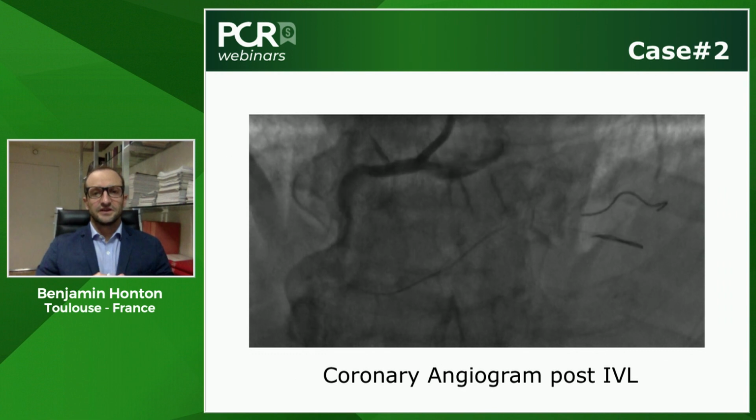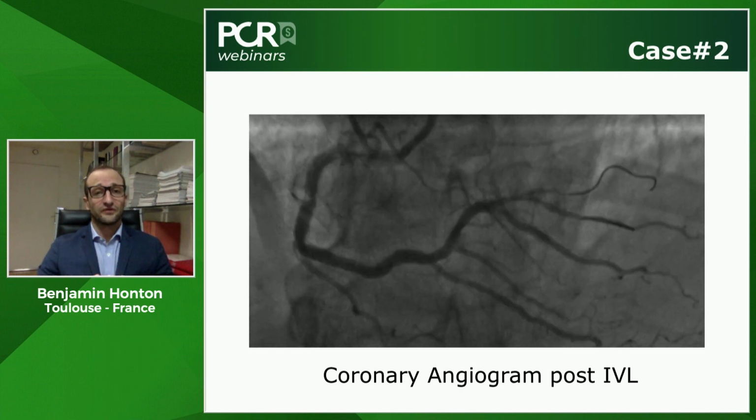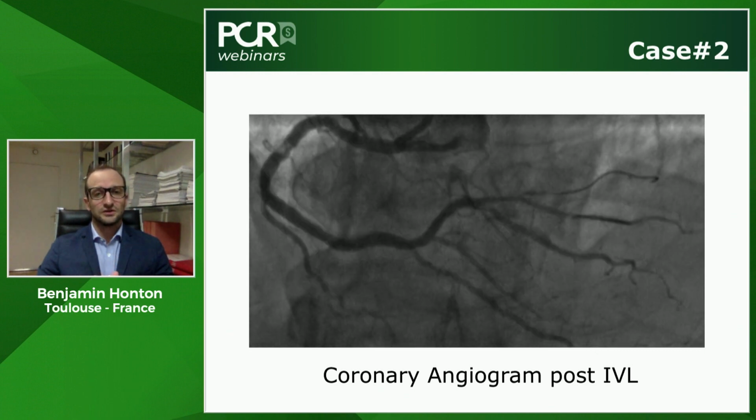So next slide. So you can see the intermediate angio after IVL, and as Michael said in the first case, it's a quite stent-like angiography post-lithotripsy without any dissection. Next.